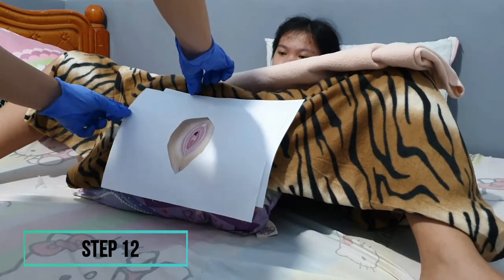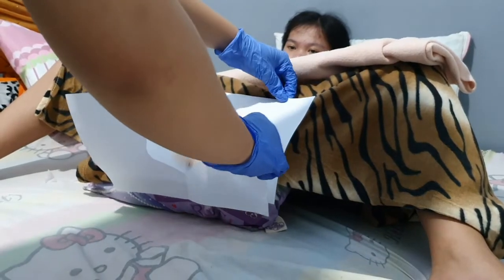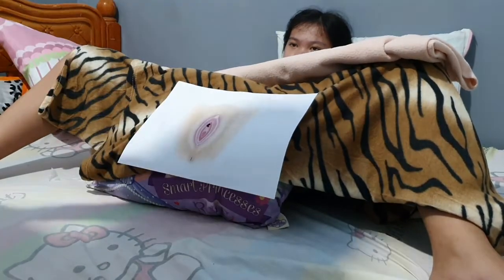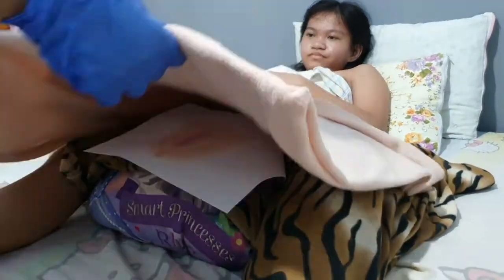Discard the equipment and supplies according to agency policy. Then finally, we can now remove our gloves. Then perform hand hygiene. We can now document all the data that we've gathered from the procedure according to agency policy.